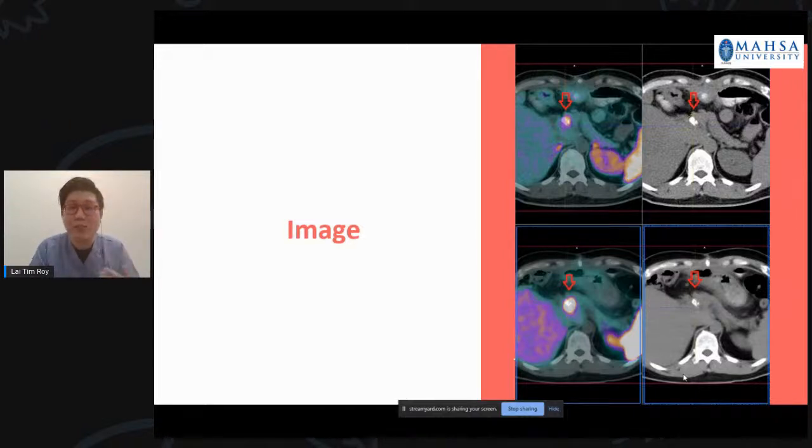Okay, and this is our neuroendocrine tumor, and you can see there are two different types. One patient did an FDG 18, and the other image is the same patient who went through gallium 68 DOTATATE. So there is still an uptake at the same region, but as you look at it, the difference is you see there's no uptake in the liver region. So this can really help doctors to have a more definite diagnosis when both are carried out, because both are sensitive to different cancers.